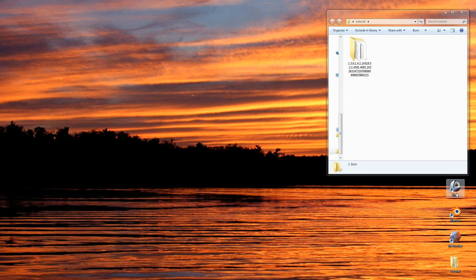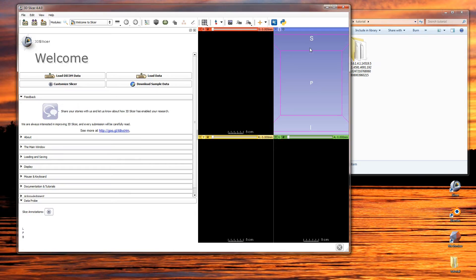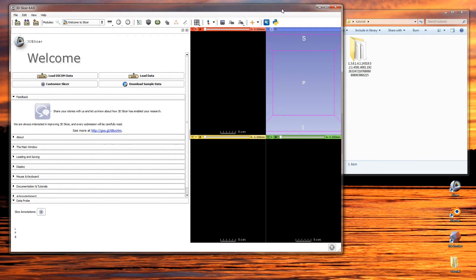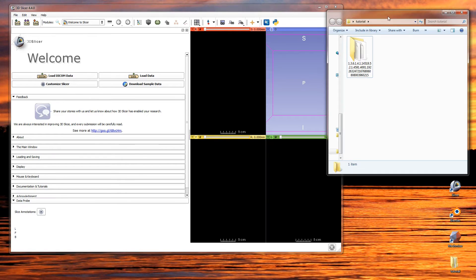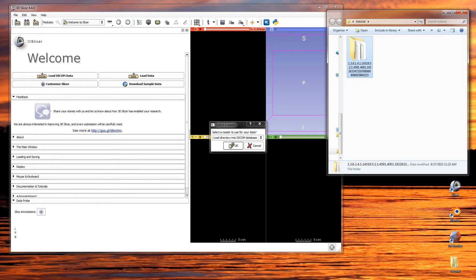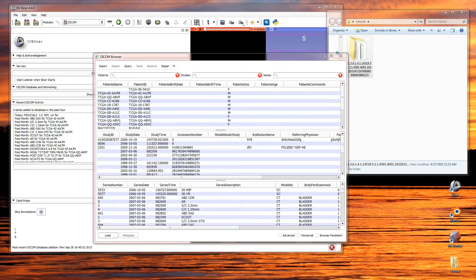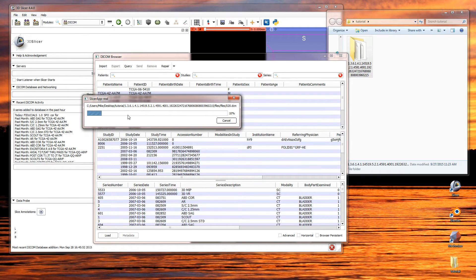Start off by opening 3D Slicer. If you haven't downloaded 3D Slicer, you can download it from slicer.org — it is a free open source software package for medical image research. If you've downloaded the file pack, you'll have the DICOM folder that contains the image set we're going to be using. Just drag and drop that onto the 3D Slicer welcome window and select 'load directly into the DICOM database and copy the files.' Your files will get copied into the DICOM database and then we'll be able to process them in Slicer.